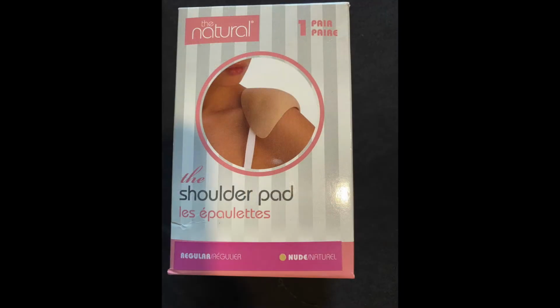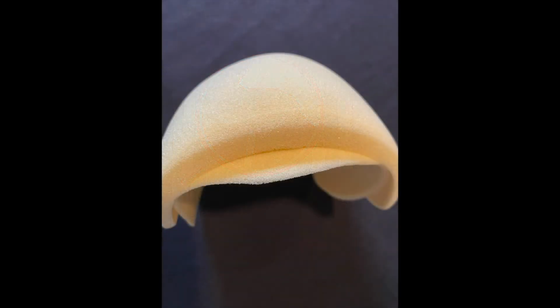You'll also want to buy some shoulder pads. Nude color works well, but since it's covered, any color would work. You'll need a pair, and they do come in a pair in each package. I am a rather slight person, and so the regular size works well for me, but you can purchase other sizes to fit your body size. First step is to open the package, take out the 2 shoulder pads, and then fit them together, small end to large end.